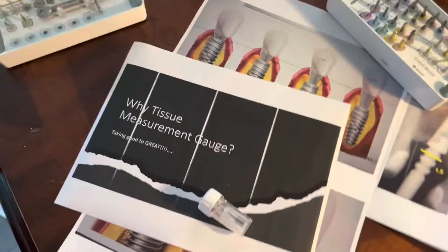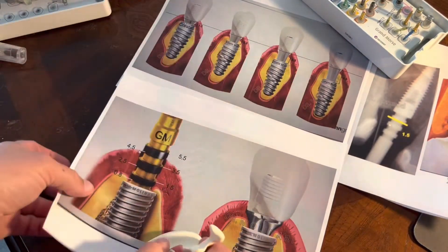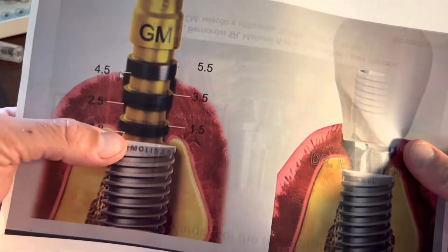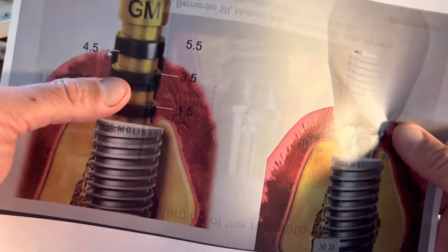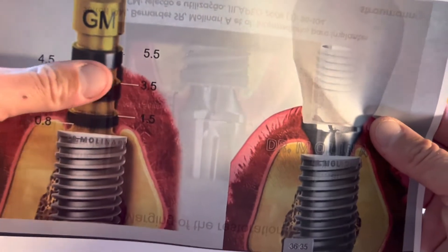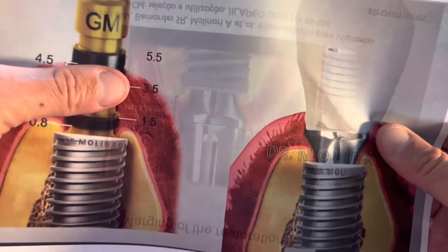You'll notice that it has a bunch of marks on the side of it. Starting from the bottom up: the bottom of the first bar is 0.8, the top of the bar is 1.5, then 2.5, 3.5, 4.5, 5.5. Typically there's tissue covering this and we see how much of the pin is exposed.